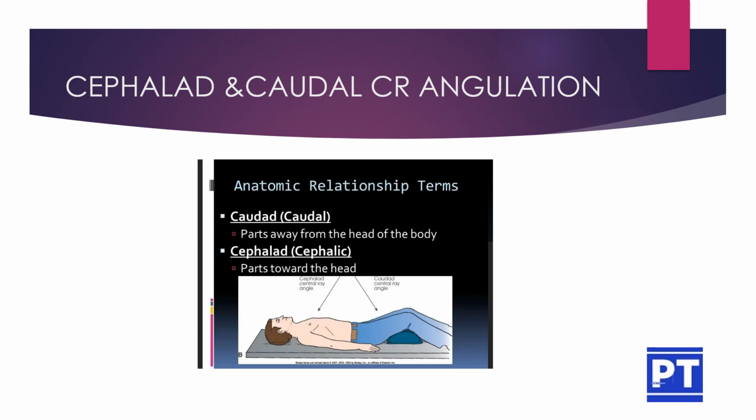This means in the above slides we have studied the position of a patient, how the patient is supine or prone, recumbent, then erect, lateral, decubitus. Many rotations, even oblique, we have studied. In some cases the patient won't be able to rotate. In such cases we will be rotating the X-ray tube. If we are rotating the X-ray tube towards the feet, it is known as caudal angulation, and towards the head it is known as cephalad angulation.